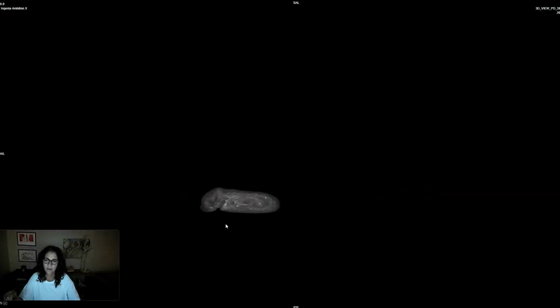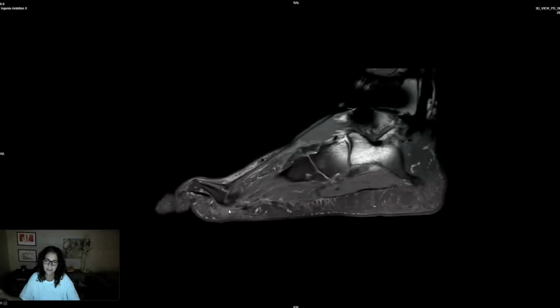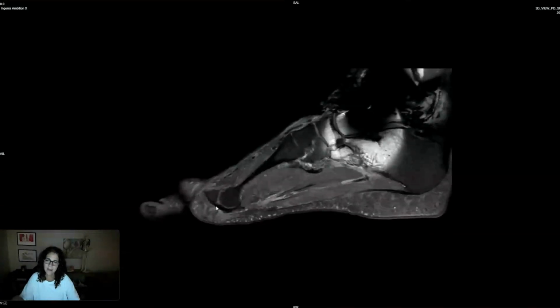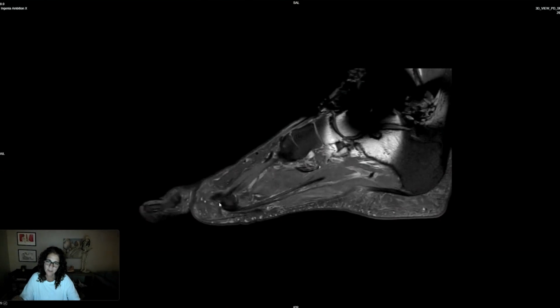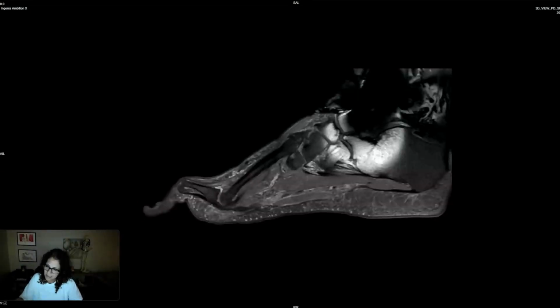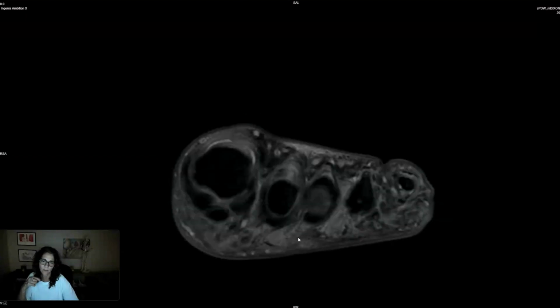I'm trying to get over to, so here's our 5th, 4th. I'm looking for plantar capsular detachments, just grossly spinning through 3rd. This is thick. Maybe there's some sprain. And here's my 2nd. And I think that what I see here is a low-grade partial tear of the plantar plate closer to the hallux side here. That's what this is right there. And I don't think it's easy for most people in the world to look at it that way. So I'm going to go over here and see what else I can use. I think this is going to be my best hope for it.